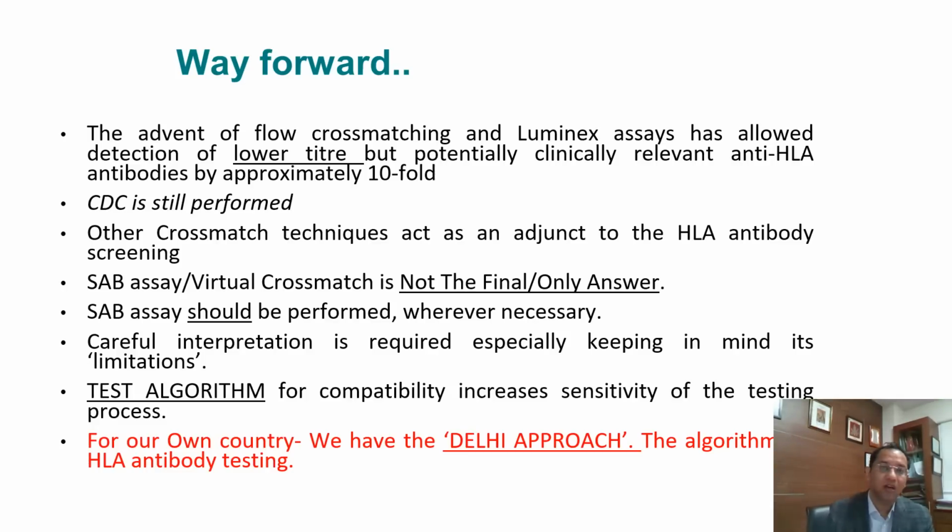For a cost constrained country like ours, we need to have an algorithm, and single antigen bead assay is very vital for the same. So I hope you have understood something about the virtual cross match, single antigen bead assay, and the need for an algorithm testing for compatibility, especially the histocompatibility testing.